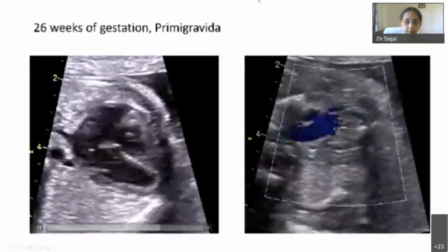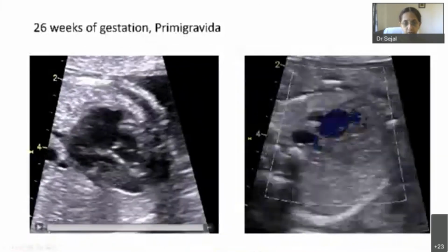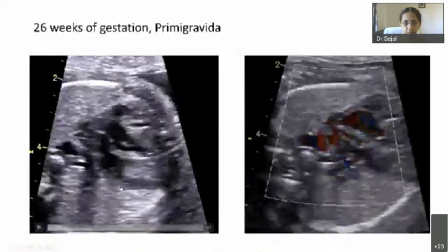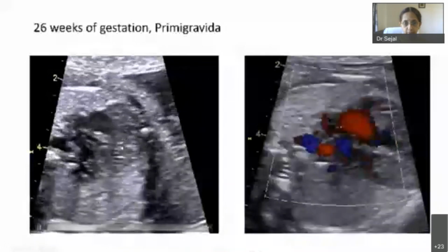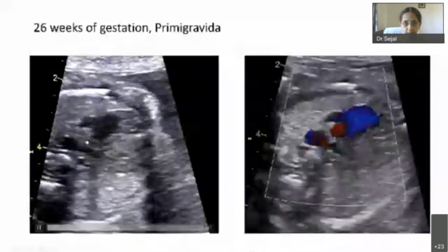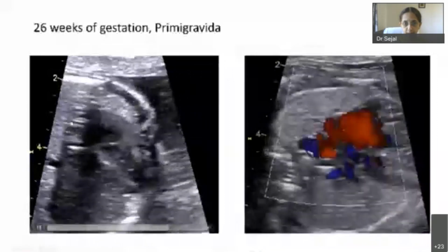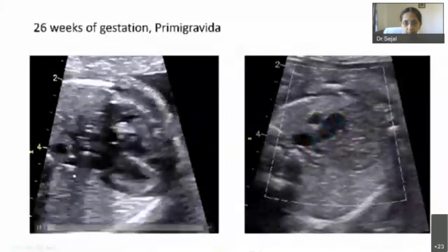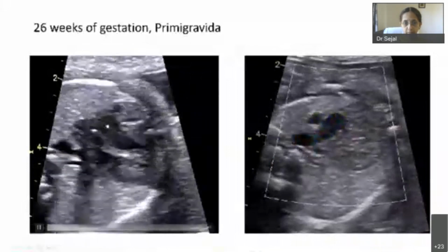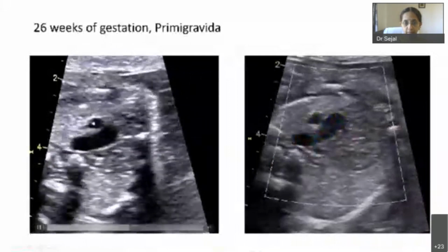Pulmonary atresia, that's very good. So yes, as we start here, this is a 4-chambered heart where you have a VSD. This is the single great vessel which is arising, and I have the smallish vessel in the place of pulmonary artery. As I go to the 3-vessel view, this is a single vessel which is coming, and then I have a smallish vessel anteriorly, this one.